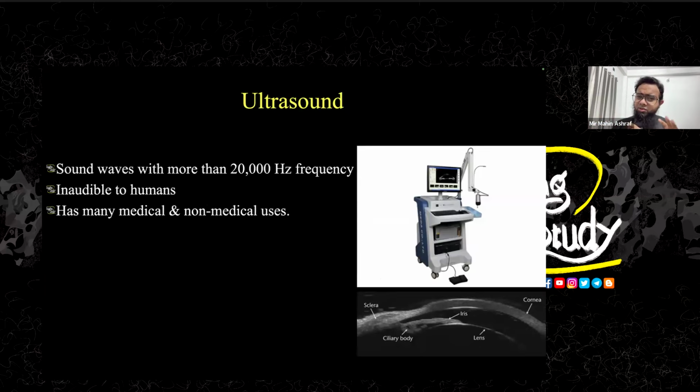So there are different uses of ultrasound. We have a separate video on our YouTube channel showing ultrasound uses, I think. So you can see different uses there. But for our medical use, we use specific values.